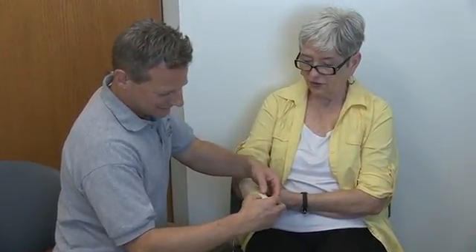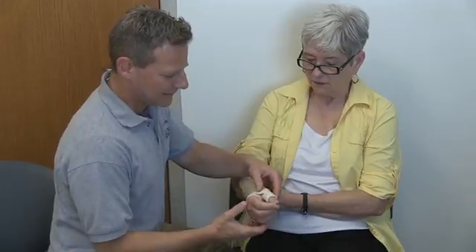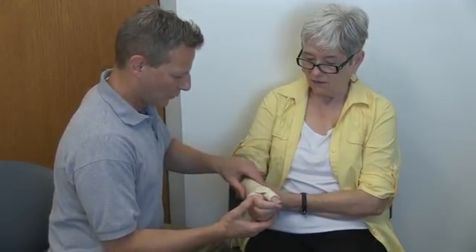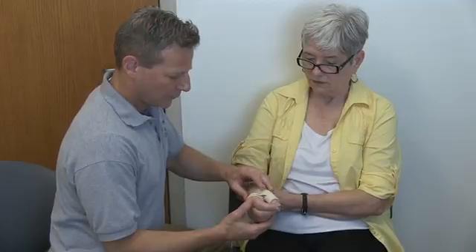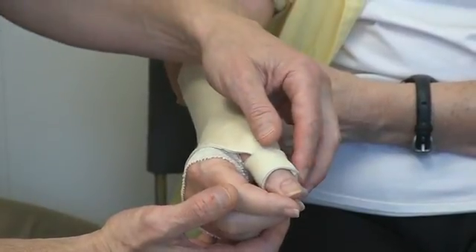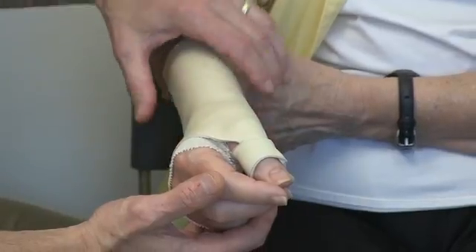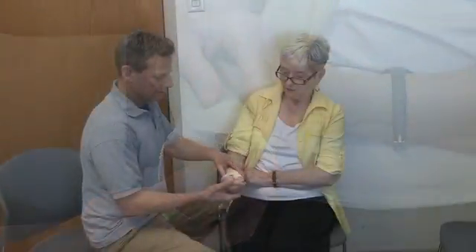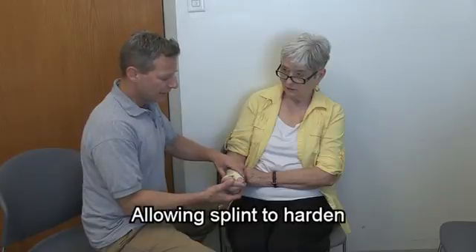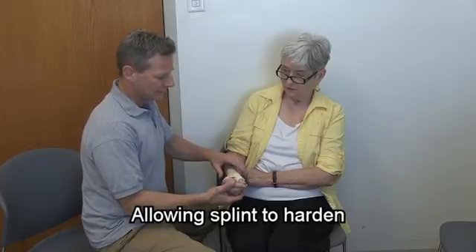It's okay. It's good. So we'll just let this get hard now. It takes a couple seconds for the splinting material to get hard.